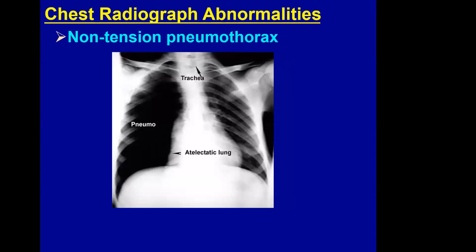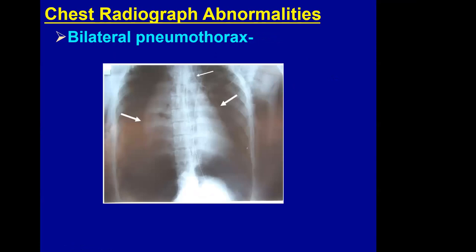Not all pneumothoraces are tension pneumothoraces. Here is a right-sided non-tension pneumothorax — the right lung is entirely collapsed, but the trachea remains centered, confirming it is not a tension pneumo. A pneumothorax can also be bilateral; this radiograph shows both lungs collapsed.